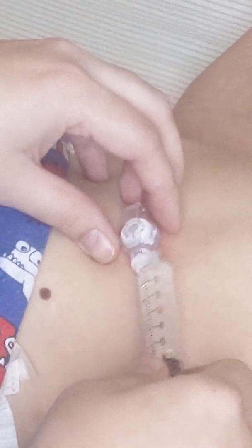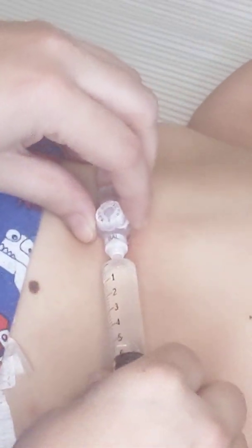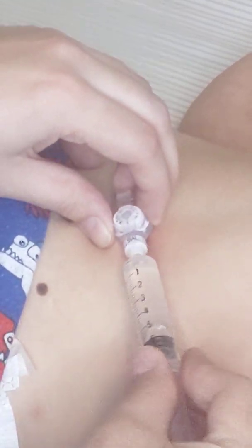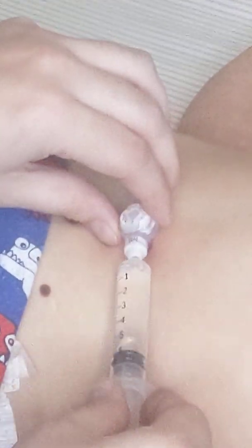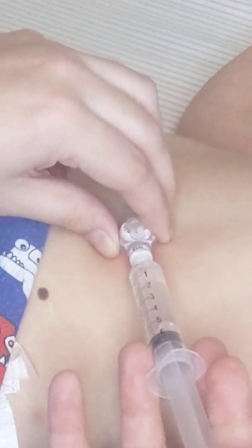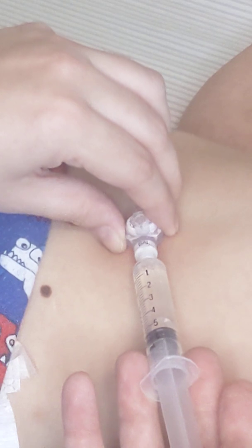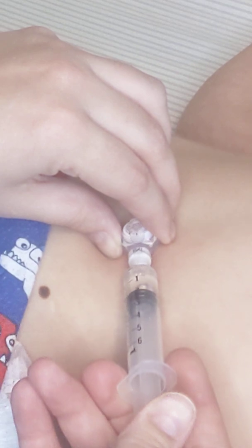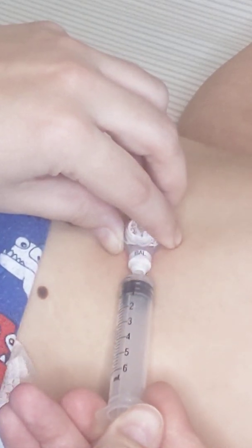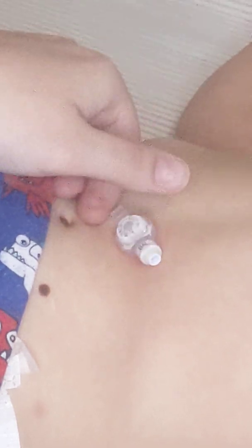That's just what we've always done. The doctor's fine with that. Some people's doctors may only say put 4, some may only say put 5. Ours said 6 was okay, so that's what we do. You're going to reinsert the syringe into the balloon valve, just like when you extracted it, and slowly push that water in. There's probably going to be some resistance. That's okay. It's just a brand new balloon. And then that's it. I turn it like that, and that's it. Very simple. Everything looks good.